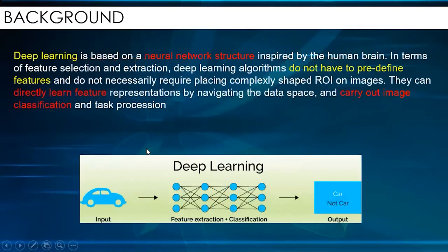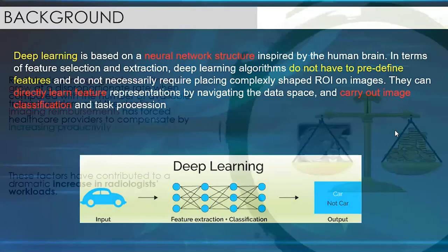While deep learning is based on neural network structures that work like the human brain, it means that the software starts to learn by itself by working. So day by day, with the increasing number of examinations, the software learns which features it can recognize and what kind of answer it can offer us in terms of classification. So they work in a really different way.